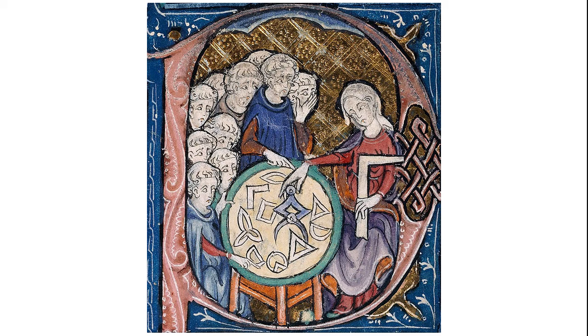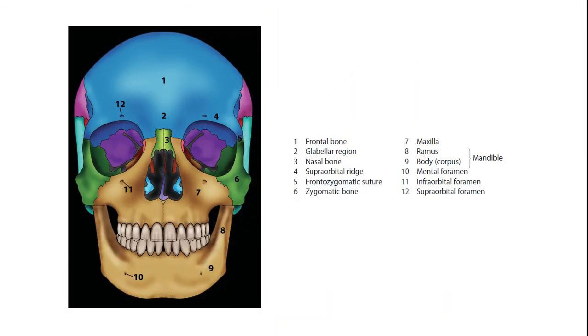Cephalometric analysis has an important place in the diagnosis, treatment planning, and treatment result analysis of patients with dentofacial and craniofacial deformities. There is a vast array of cephalometric analyses. Each analysis has some merit, yet will not be applicable in all cases.